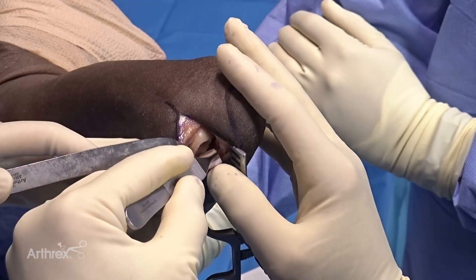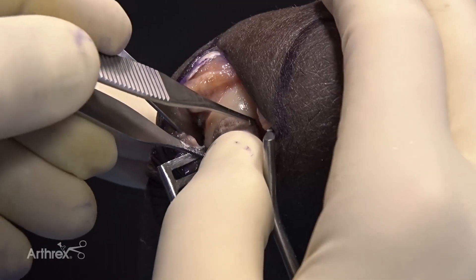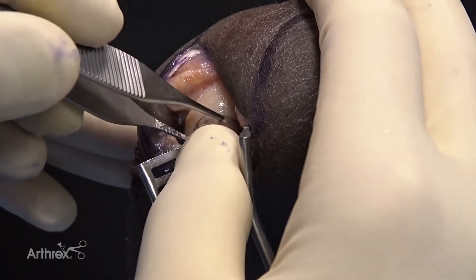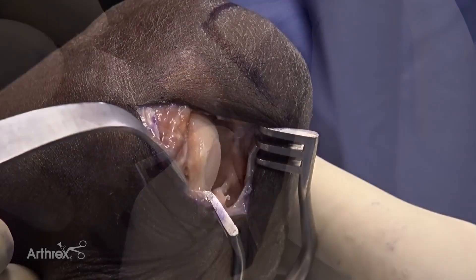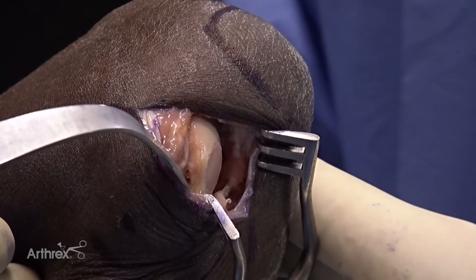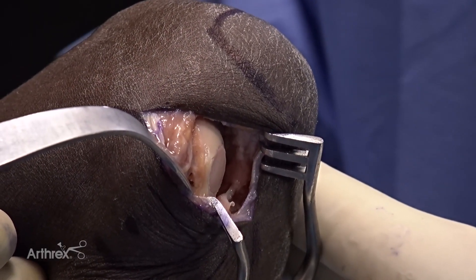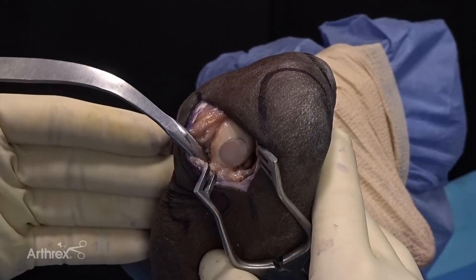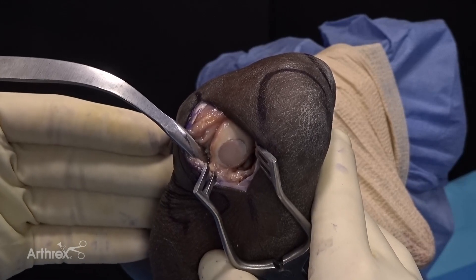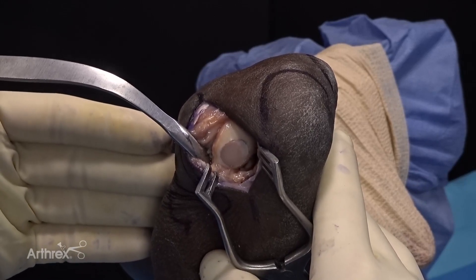We will now proceed with implanting the graft. Once the graft is fully seated, we can take the elbow through a range of motion, followed by lavage of the wound, capsular and anconeus repair, and skin closure.